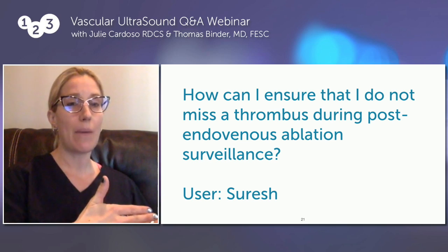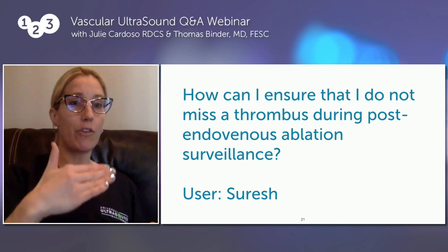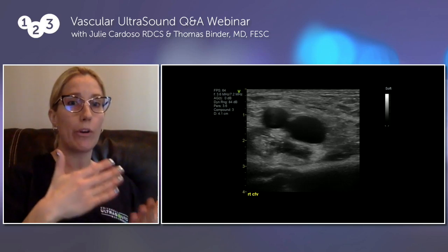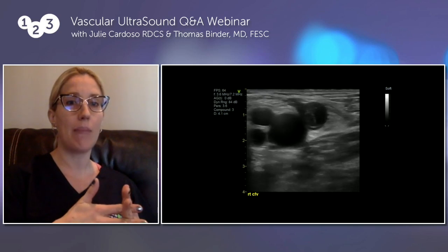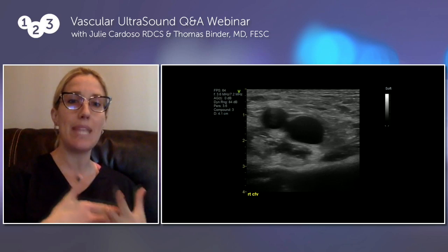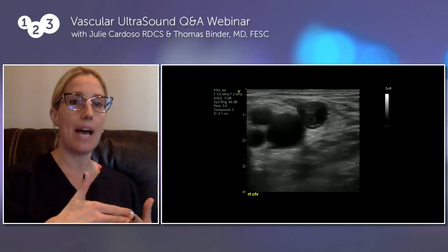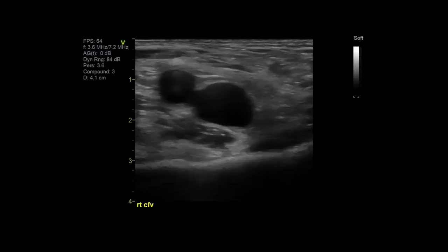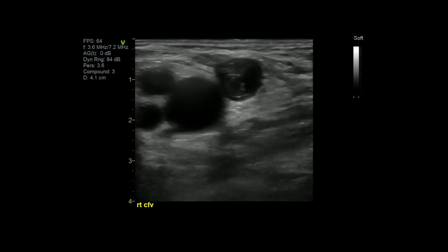So it's important that we assess these areas in the transverse view and get a lay of the land first, and not start right away with our compression maneuvers, because we don't know what we're encountering, especially when we go to this loop here. You can see I'm looking at the common femoral vein going into the saphenofemoral junction in the transverse view. Notice how I'm not compressing and I'm getting a lay of the land, and you can see echogenicity in this lumen. So this is a heat-induced thrombus extension, and we're going to visualize this in the longitudinal view.